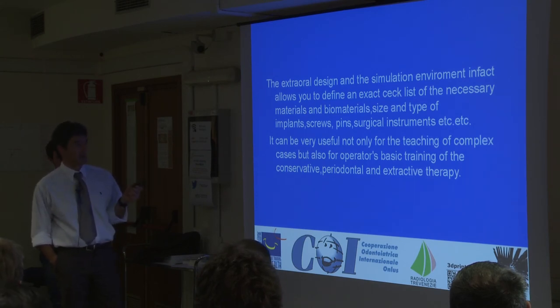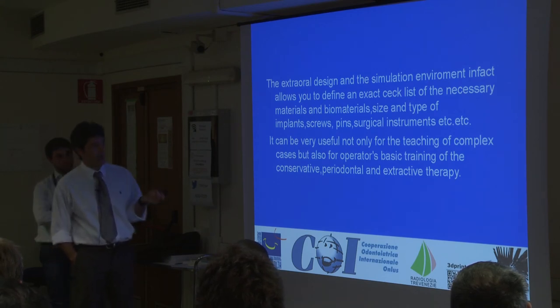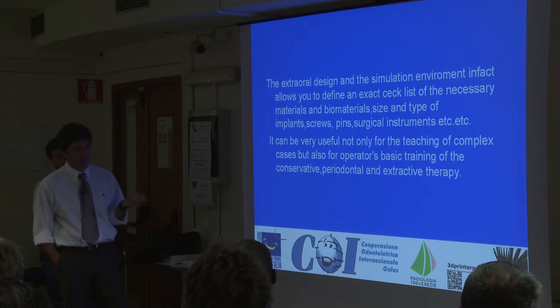It can be very useful, not only for the teaching of complex cases, but also every day for the operator's basic training in conservative, periodontal, and extractive therapy.